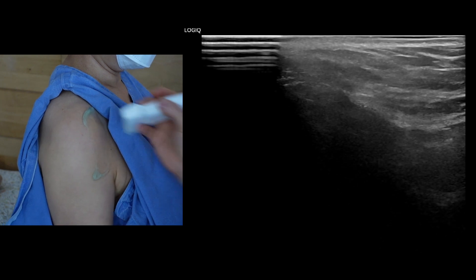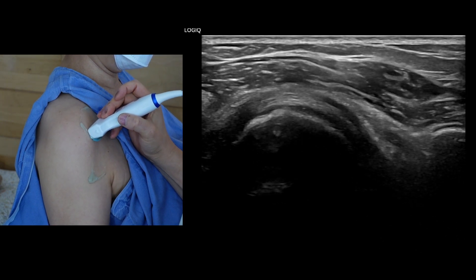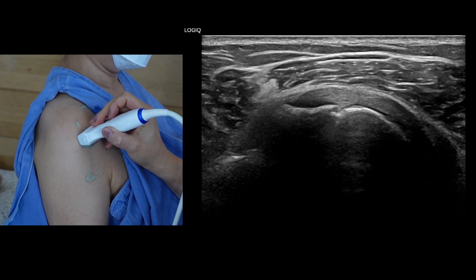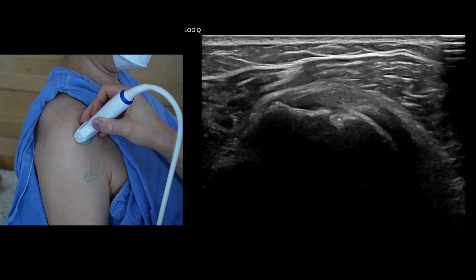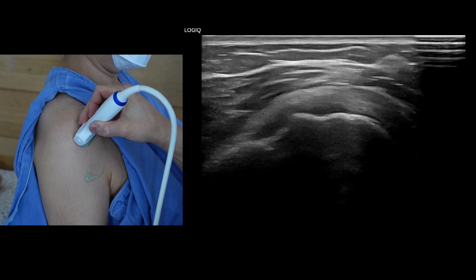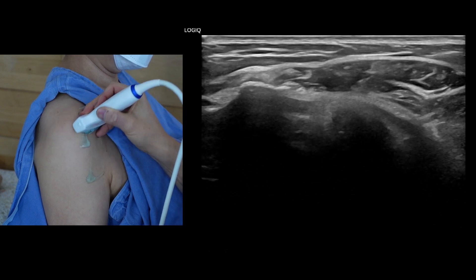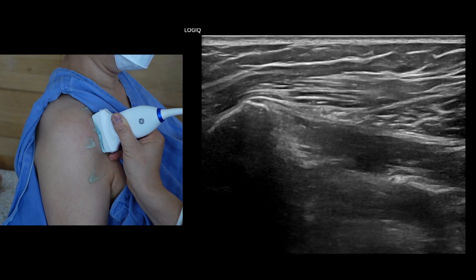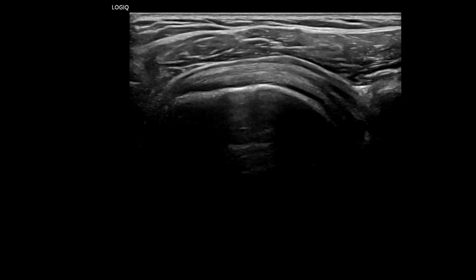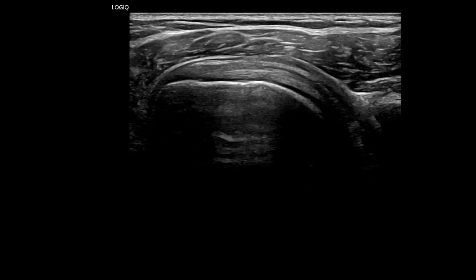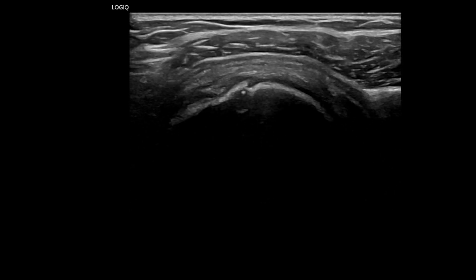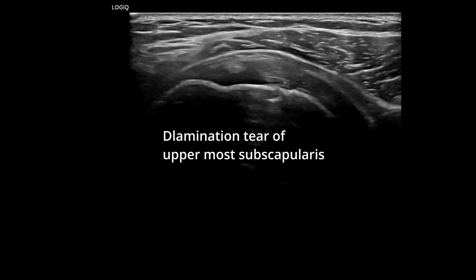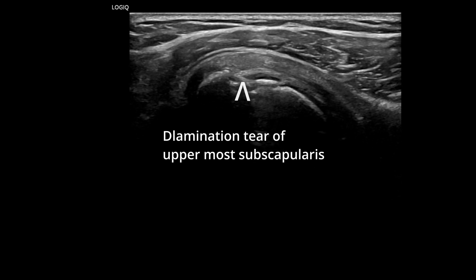For the subscapularis tendon examination, position the patient's arm in external rotation, fixing the arm against the lateral chest wall to visualize the subscapularis tendon attaching to the lesser tuberosity. Assess the tendon in its long and short axes, observing its behavior during passive external and internal rotation with the arm hanging. Slide the transducer up and down across the subscapularis to display its entire width. The tendon's width and thickness can vary due to the interdigitation of muscle and tendon fibers; hence, it is essential to scrutinize the uppermost portion of the subscapularis tendon, as minor delamination tears are commonly missed here.